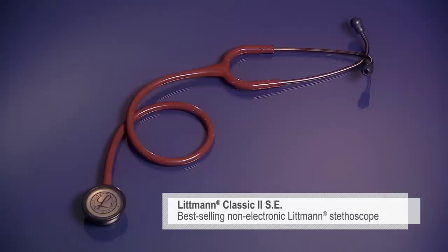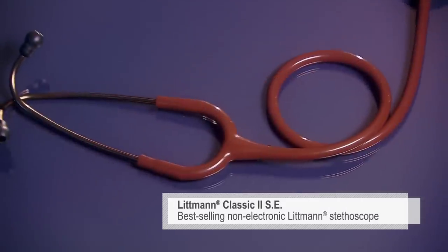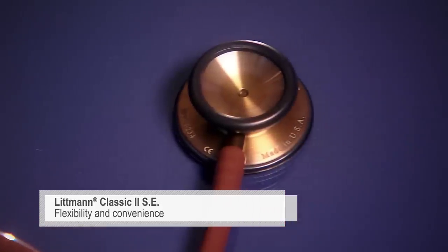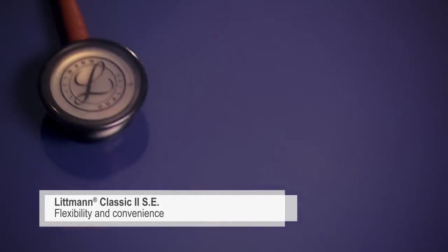The Classic II SE is our best-selling non-electronic model. The two-sided chest piece gives you the flexibility of a traditional open bell on one side and the convenience of a tunable diaphragm on the other.